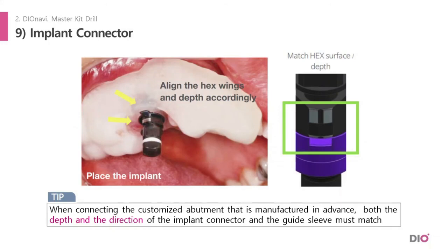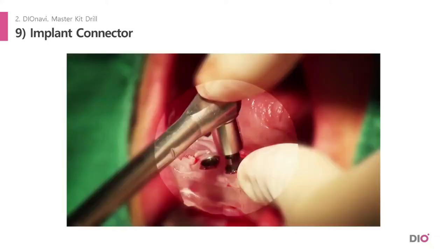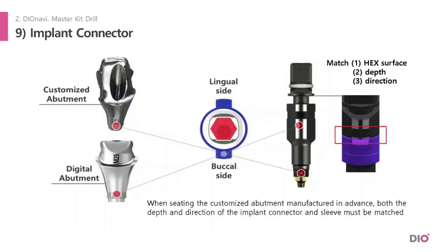Also, if you want to connect a customized abutment or H-scan body, both the depth and the direction of the implant connector and the guide sleeve must be matched. The white line on the connector and the bump on the sleeve must be aligned if you have a prosthesis made in advance. If you're going to place a healing abutment, there's no need to align it. But when seating a customized abutment or an H-scan body, you must align the white line on the buccal side. You have to match this marking line and the protruding bump of the guide sleeve like this if you have any pre-made prosthesis.